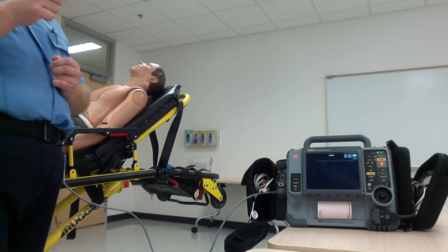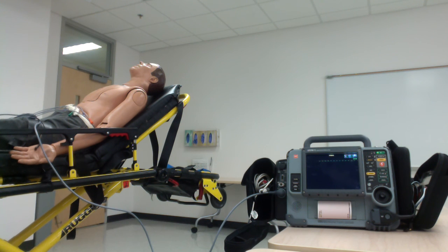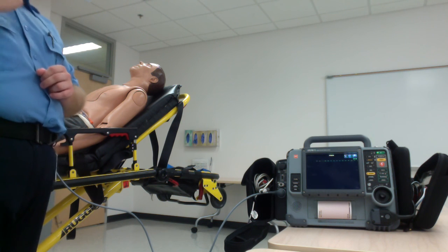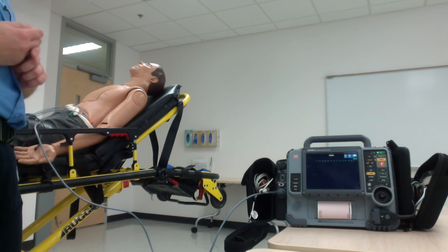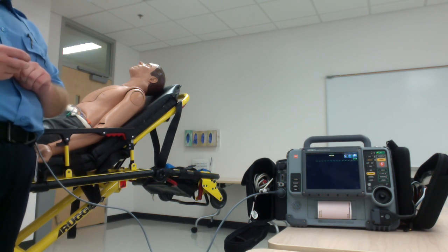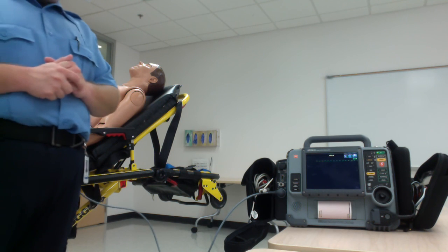That box where it tells you what's going on, a lot of times it can be quite inaccurate. It's great just to look at and get an idea of what's going on. However, you can't really use that box to confirm that this patient's having a heart attack. Certain agencies actually require you, believe it or not, to use that box to call a heart attack. I want to say there's one agency down near Charlotte that does that. Unless that little box says that this patient is having a STEMI event, you cannot call the STEMI, call the cath lab, and let them know what's coming in.